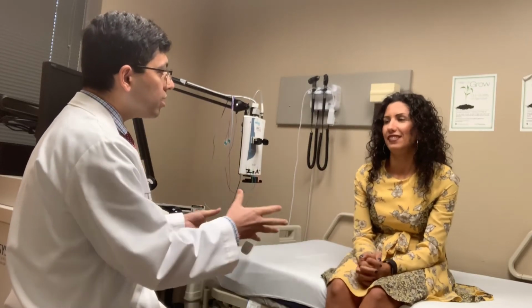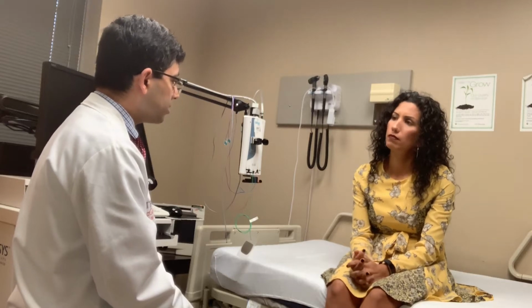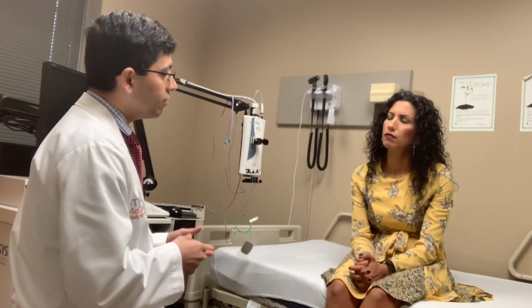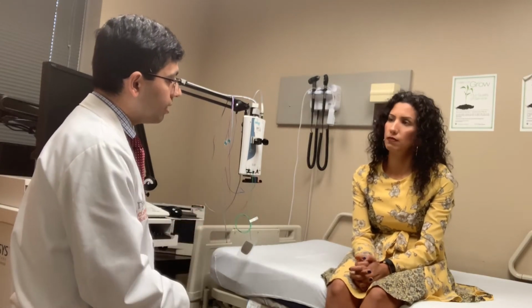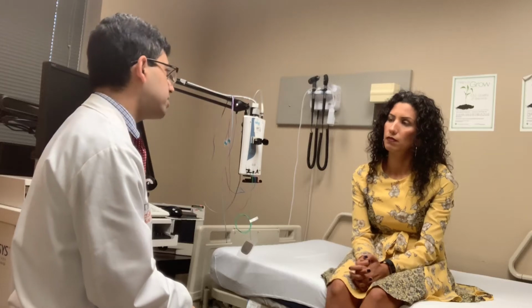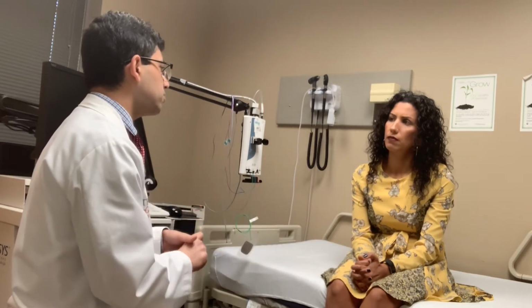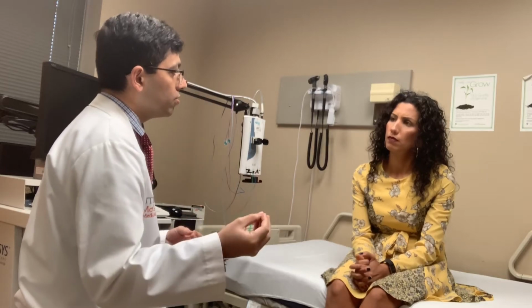So I'm going to tell you briefly what to expect in this test. This test has two parts. In the first part, we check your nerves, and in the second part, we check your muscles. Your doctor sent you for a particular condition, and this test is very important for your doctor to make a final diagnosis.